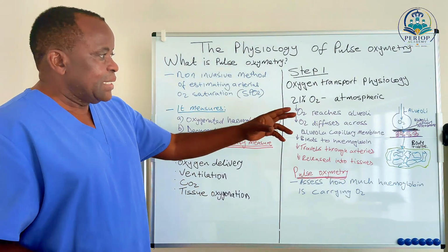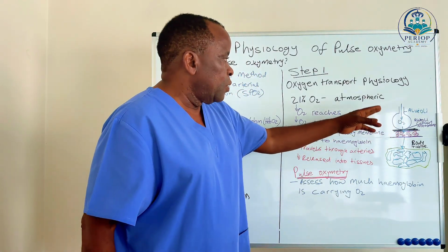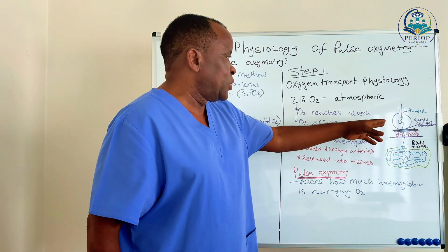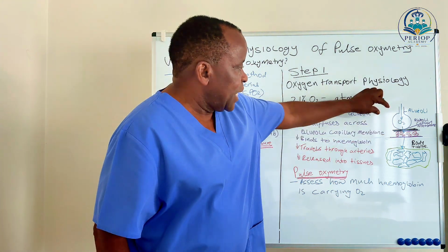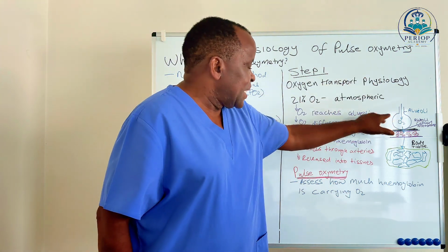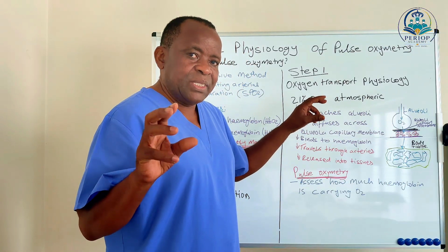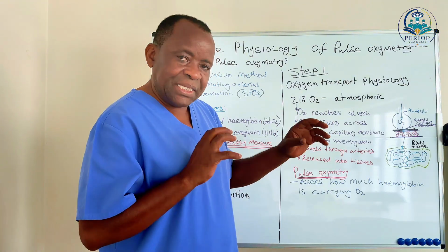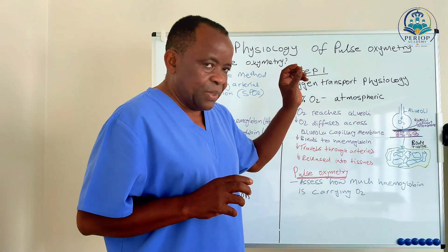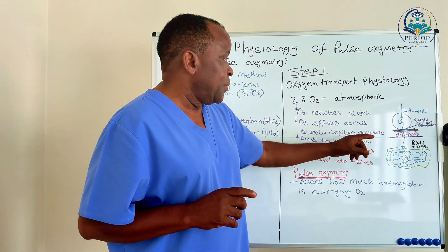As an illustration, I've shown this little drawing. Sorry for my drawing, I'm not so good at it. We have the alveoli sac with oxygen. Just consider that I'm not looking at gaseous exchange per se; I'll restrict my conversation to oxygen alone.